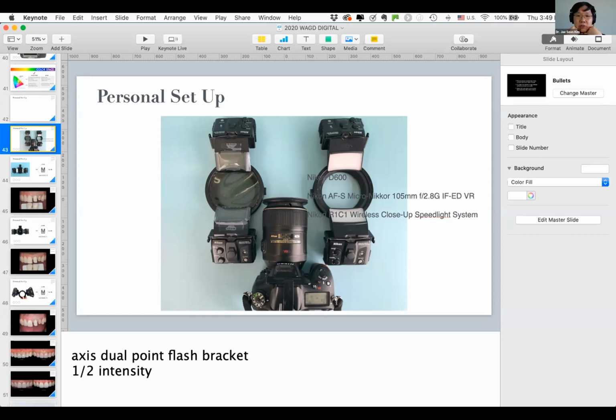I used to use them, but Dr. Hess actually hosted with Dr. Ramos a course by Claude Sieber. He's one of the best photographers in the world, and he's a ceramist, and he recommended to take off all filters and coverings from the lenses. It does create a little bit of aberration, so I've been taking them off since, so I don't use any covers on the lenses.